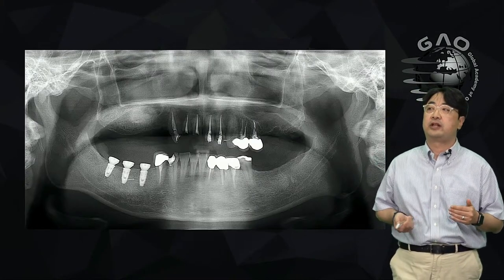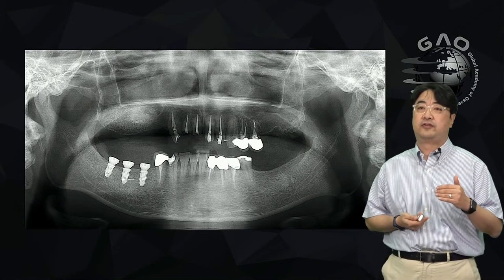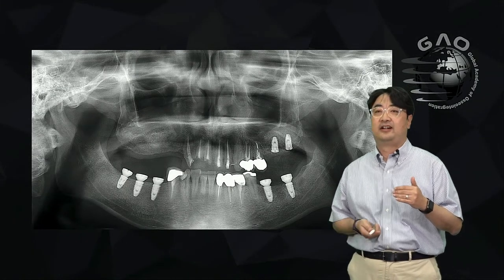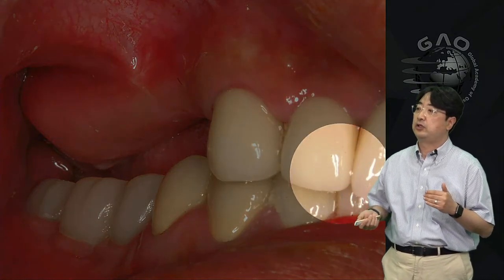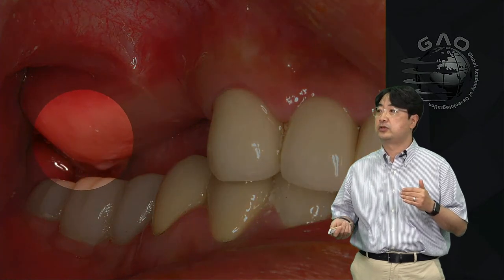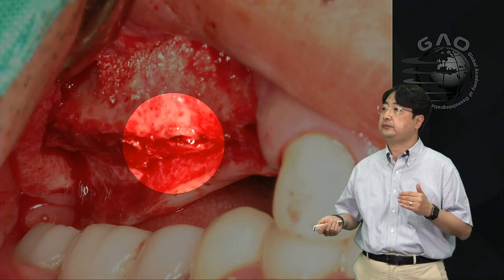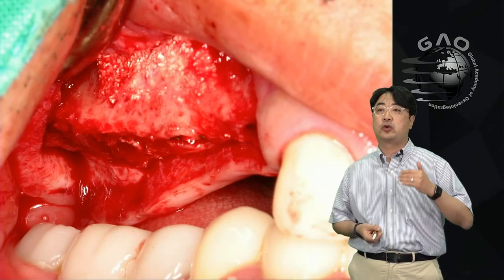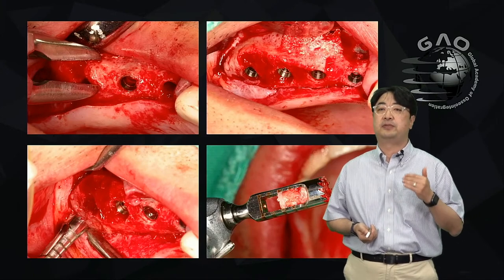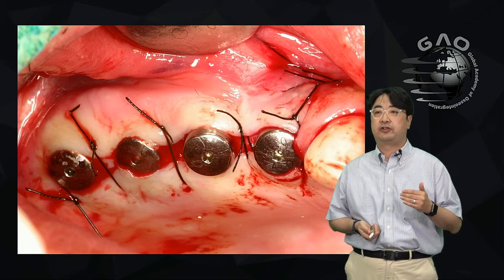This is the radiograph. As you see, there is radiopacity on the sinus of the right side, posterior. After a while he placed the implants here and there. Now you can see, after he put in the lower teeth, how much space we have. We don't have that much space on the posterior here, right? This is the picture at the surgery. As you see, he removed the cortical bone from the top. Then he placed the implant, and he did some trephine biopsy. This is how it looked after implant placement.